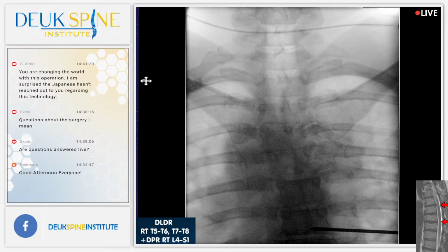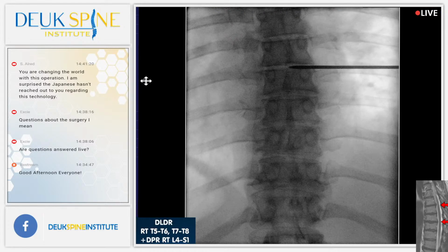That's good. Let's get a shot. All right, so we can see 12, 11, 10, 9, 8, 7. I'm right at 7, 8. All right, I'm happy with that.